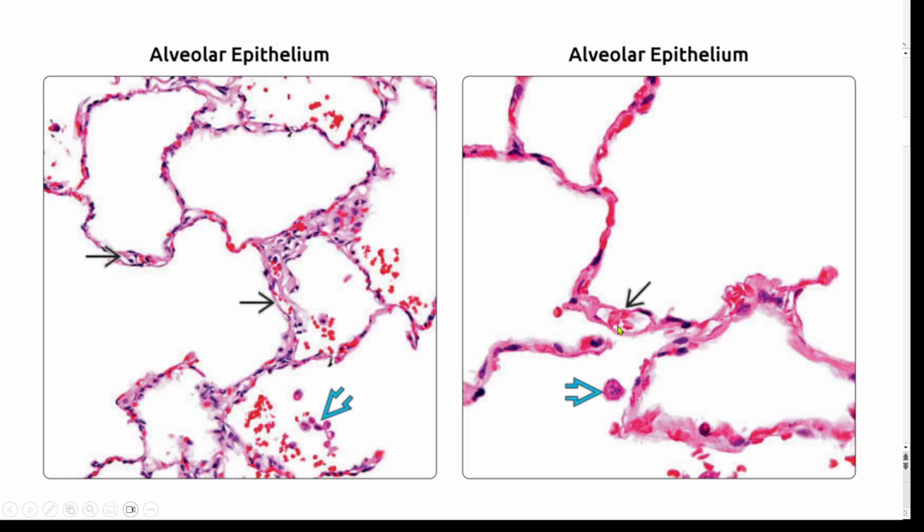You see how close the red blood cells are to this space, which has more oxygen than this area and has less CO2 than this here. That's basically the function of the pneumocytes, having a very thin wall, and the endothelial cells also have a thin wall here because these are capillaries. We cannot really distinguish which one is which. Is it a pneumocyte? Is it an endothelial cell? Unless we do stains. So it's very important to remember the very thin structures in here.